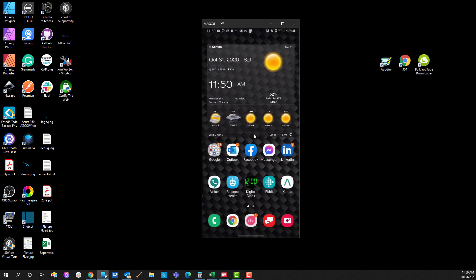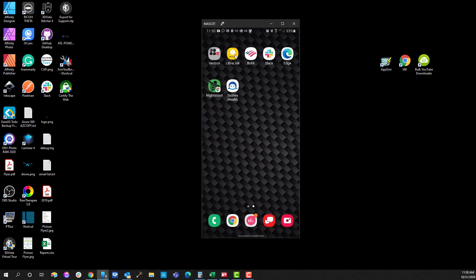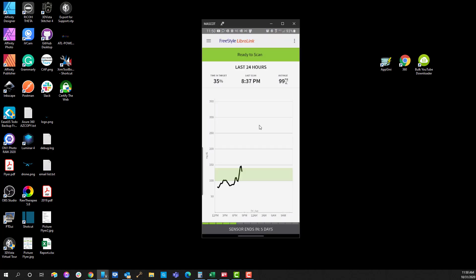So let me jump over here to LibreLink which is the app that you use to read your sensor natively without using the technology of Bubble. So what you do is when you set this up, you have to create an account. And so with that you have your account settings and password.